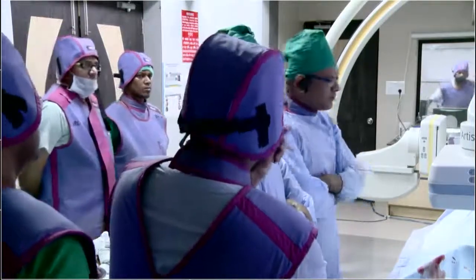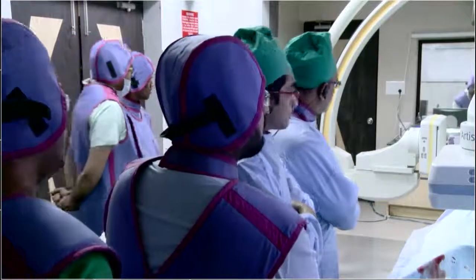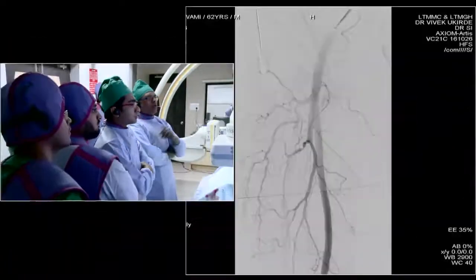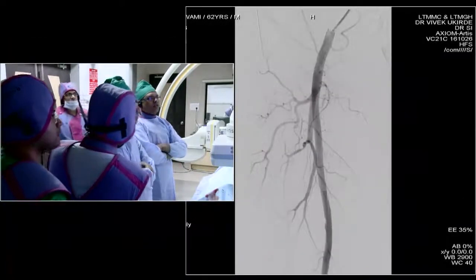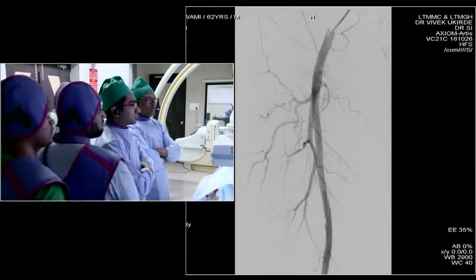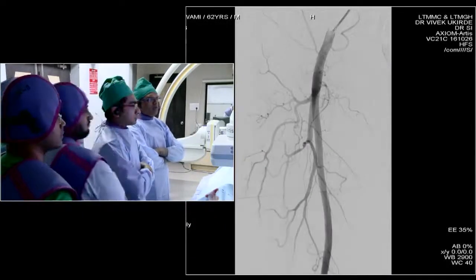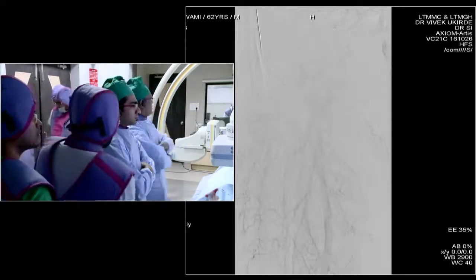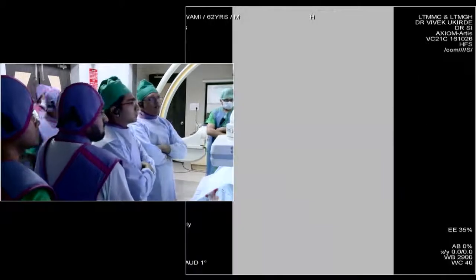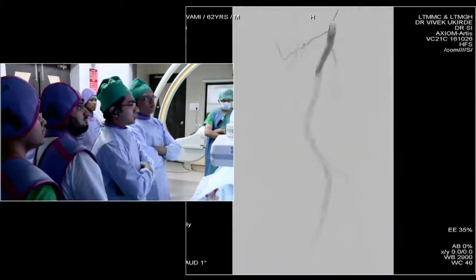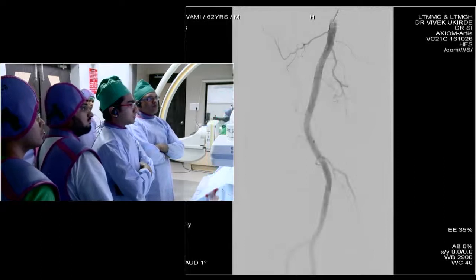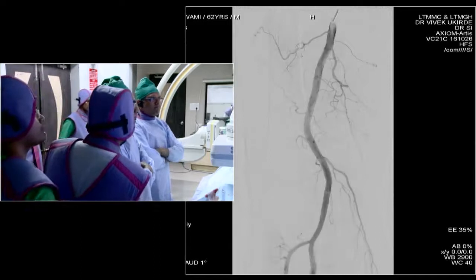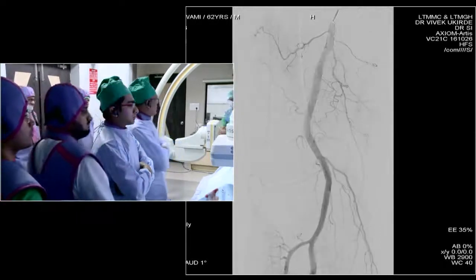Here are the angiogram runs. This is the superficial femoral artery on the right side, which looks good — there are a few areas of calcification but the flow is good. This is the popliteal and the trifurcation, which looks very nice.